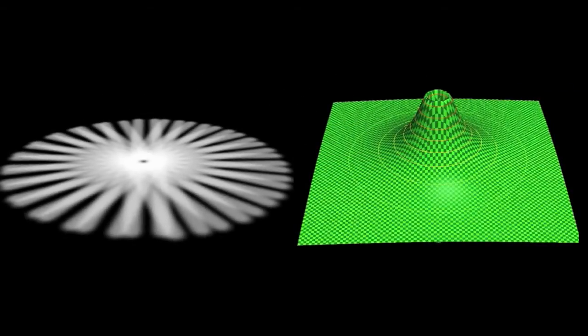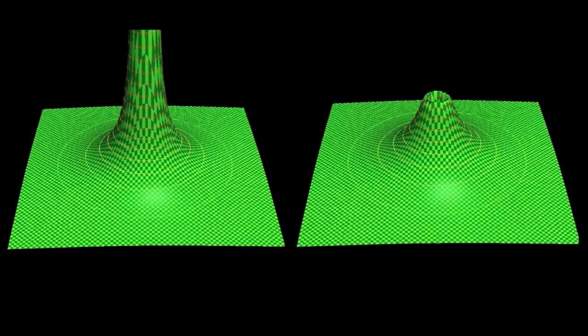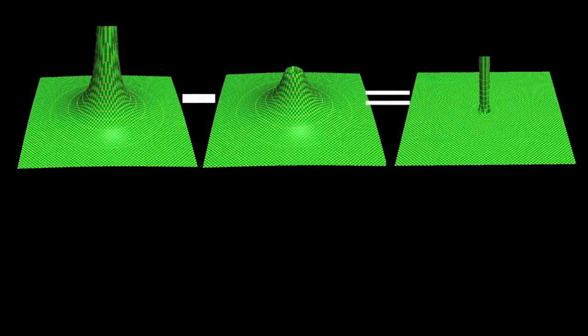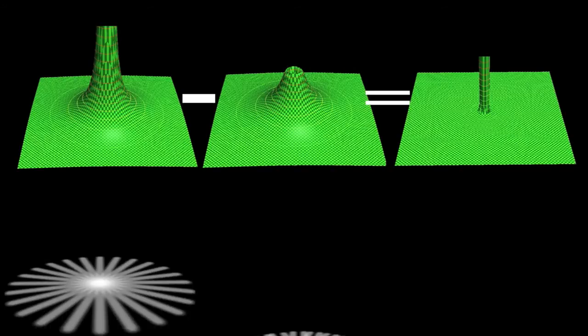So now we've built ourselves 2 pictures, which are almost identical, but if we subtract one from the other, all the crud around the outside disappears, and just a blip in the middle is left. And that's Cat's nose stud. That's what we wanted. So what about if we use this trick for the whole image? Maybe we can discover who this celebrity is.